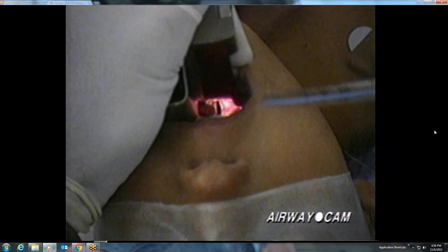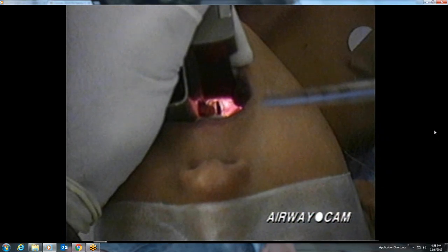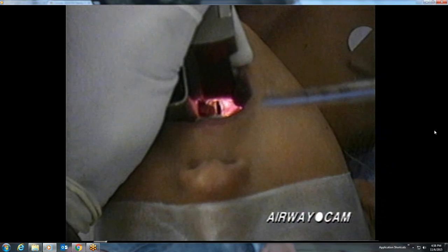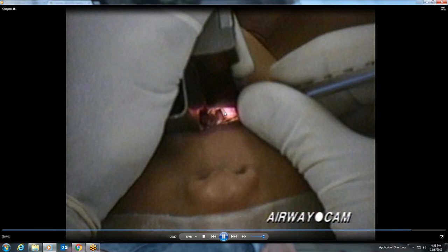Cuffless endotracheal tubes are generally used in pediatric patients under the age of 8, because the narrowest part of the pediatric airway — unlike in adults — is below the vocal cords. In this still shot of endotracheal tube placement, the vocal cords can be seen adjacent to the tube. Note the anterior commissure of the larynx. The epiglottis is not visible.